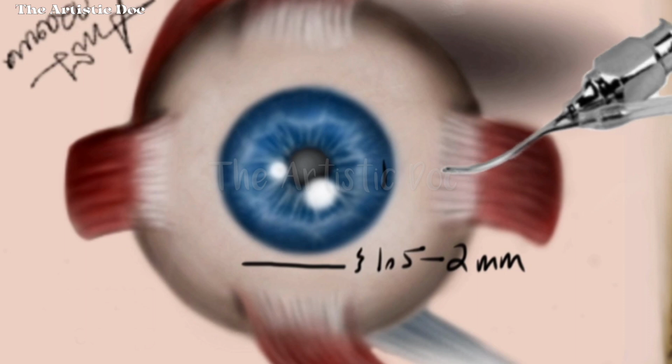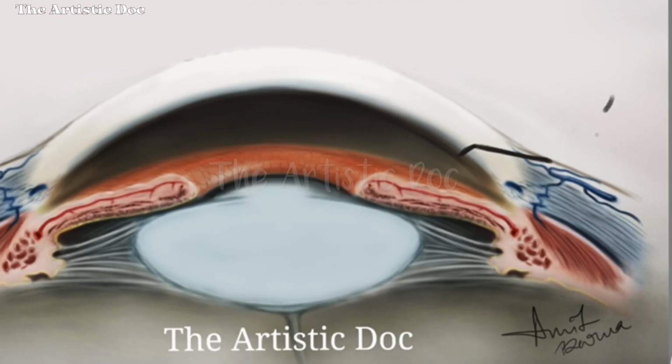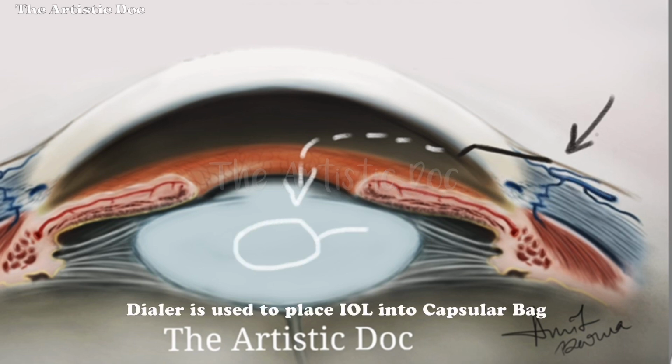Aspiration of the cortical material is done by Simcoe's bi-way irrigation aspiration cannula through the side port. Fluid is given through the irrigation port and the whole matter is aspirated via the other port. Finally the IOL is inserted via the sclerocorneal tunnel by McPherson's forceps and dialed into the capsular bag by Sinskey's hook or dialer.